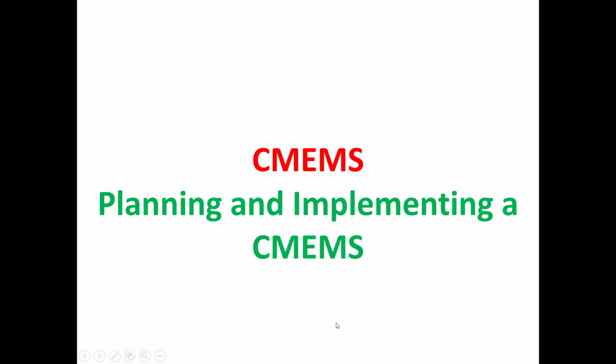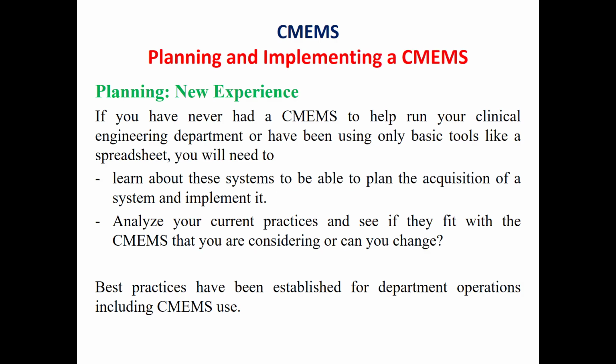So after we have seen a practical example for a computerized medical equipment management system, which was the HEMS, now we will talk about planning and implementing a computerized medical equipment system for a new department or for new clinical engineering users.